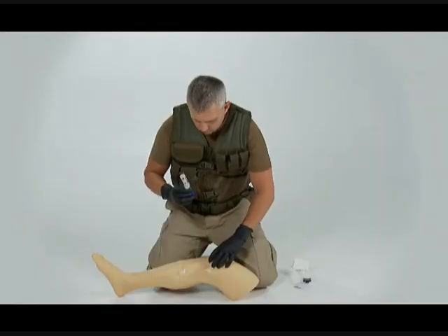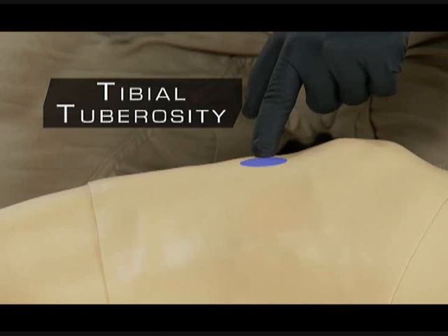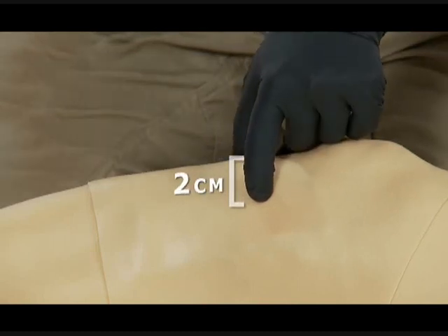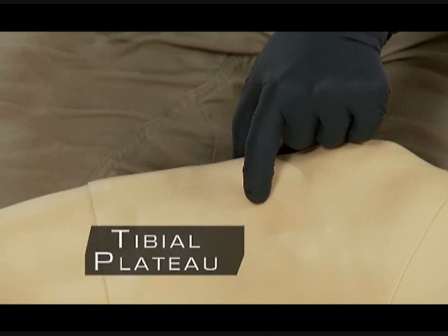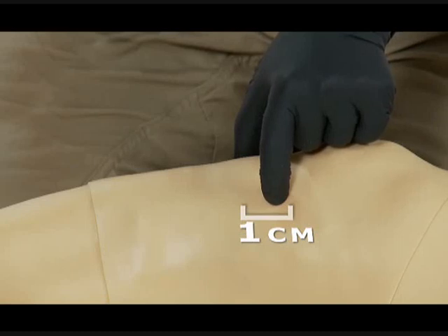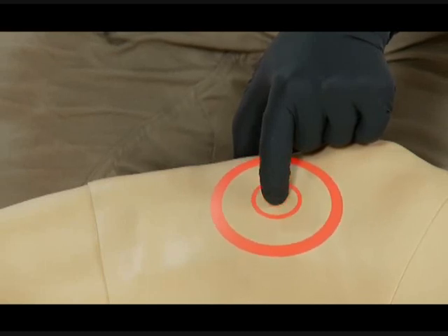To locate the tibial tuberosity, palpate down from the patella, or kneecap, toward the foot until you feel a rounded protrusion. This rounded protrusion is called the tibial tuberosity. For adult placement, begin at the tibial tuberosity and go approximately two centimeters medially, or toward the inner part of the leg, to find the flat portion of bone called the tibial plateau. From the tibial plateau, go up approximately one centimeter, or a half an inch, toward the patella. Our goal is to deploy the needle through the thinnest portion of the cortex and in the area that contains the highest vascular content.